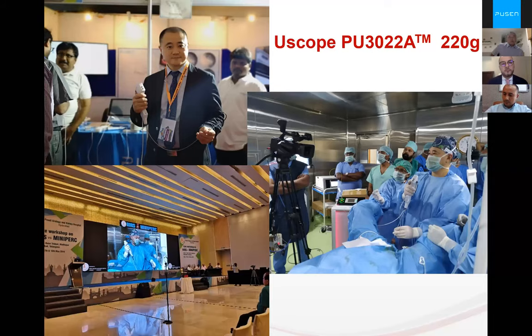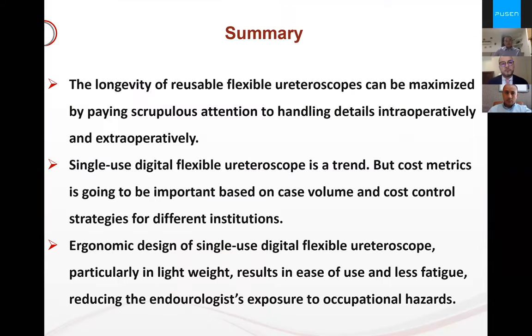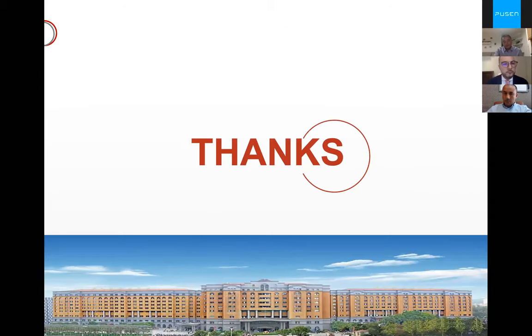So we reached the conclusion. In summary, the longevity of reusable flexible ureteroscopes can be maximized by paying scrupulous attention to handling details intraoperatively and extraoperatively. Single-use digital flexible ureteroscope is a trend, but cost metrics are going to be important based on case volume and cost control strategies for different institutions. Ergonomic design of single-use digital flexible ureteroscope, particularly being lightweight, results in ease of use and less fatigue, reducing the endourologist's exposure to occupational hazards. So, thank you for your attention.